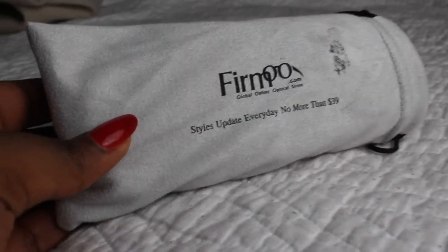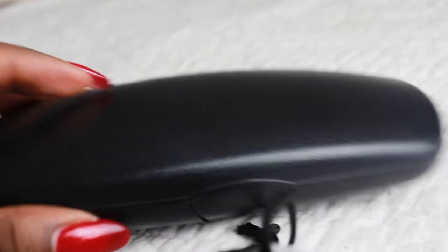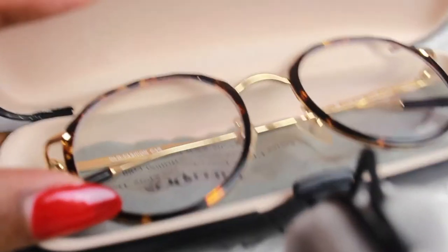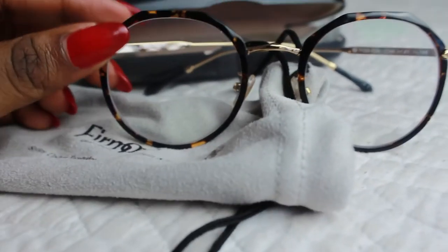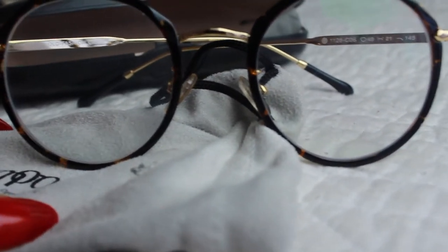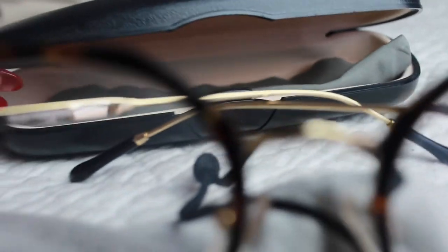Now I'm going to go into the packaging and show you guys what I got. Within my package I got a pouch, and one of my favorite things about it is that it comes with a little screw and replacements for the nose pads. They were thinking ahead — that's what's included in the packaging.